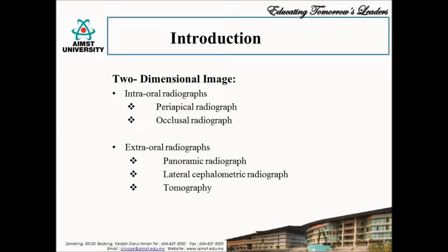Two-dimensional imaging, as the name indicates, means one can view the image in only two dimensions, where mesiodistal length and superior-inferior height can be measured, but not the buccolingual width. For preoperative implant evaluation, only mesiodistal and superior-inferior directions can be evaluated with these two-dimensional images.